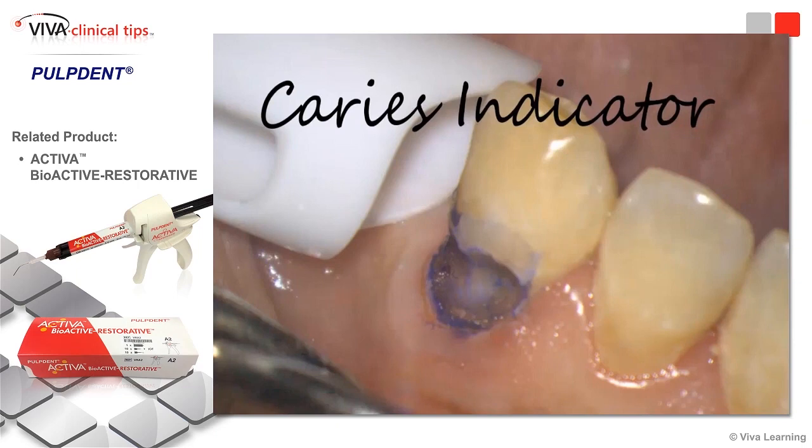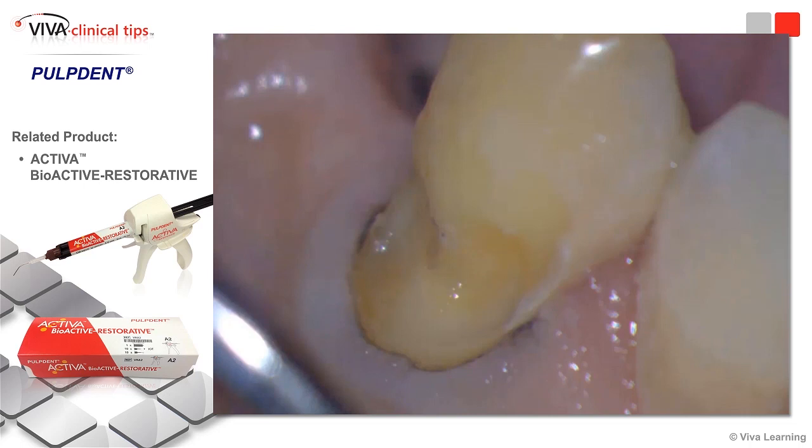Once we get a fairly good caries removal, what I will typically do is place the caries indicator — and you can see that it's blue. I would be a little bit concerned, especially going subgingivally on the tissue. The blue definitely makes an excellent contrast, and what we'll do is remove caries and create a clean border.